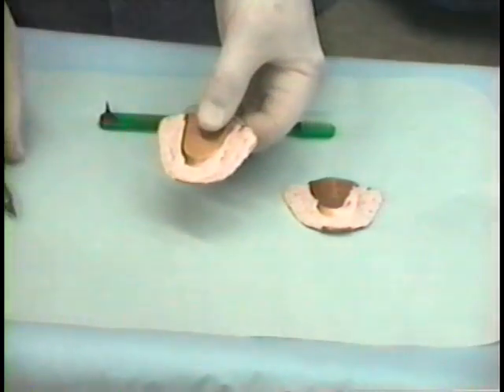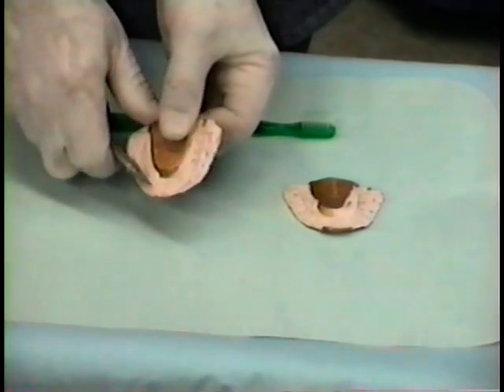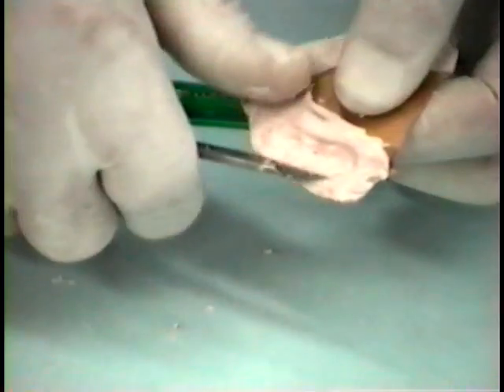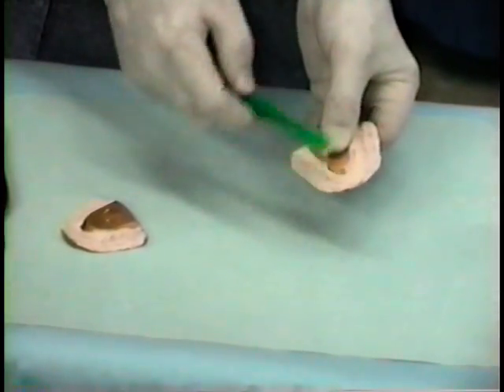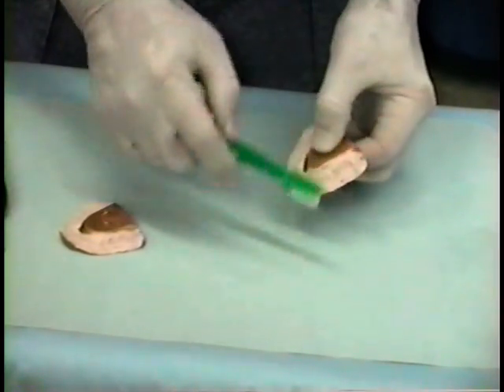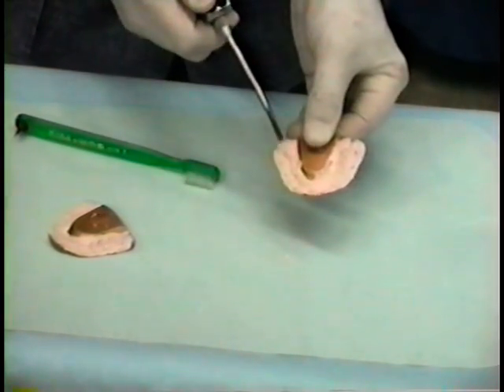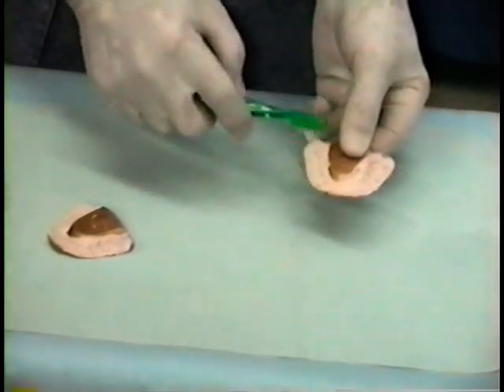The next step is to take a sharp Bard Parker scalpel and trim off the excess material that may be impinging on the tissues or preventing the teeth from seating all the way. Use of a soft toothbrush or compressed air is the ideal way for cleaning the particles that cling to the ZOE.